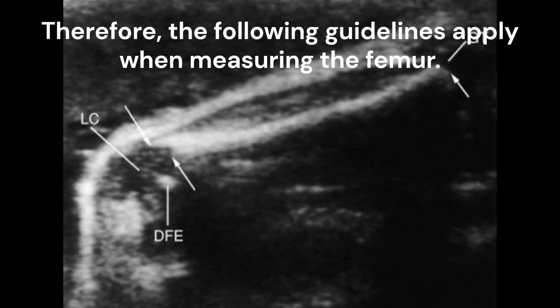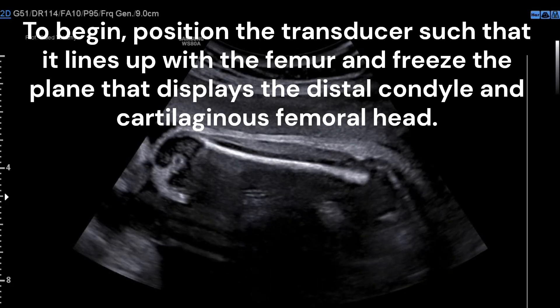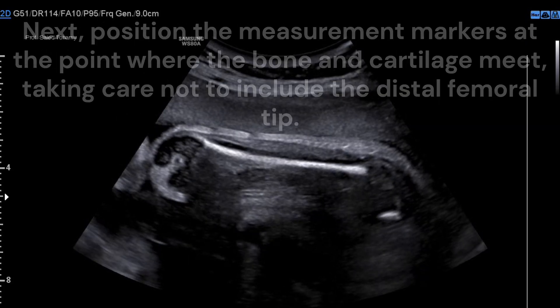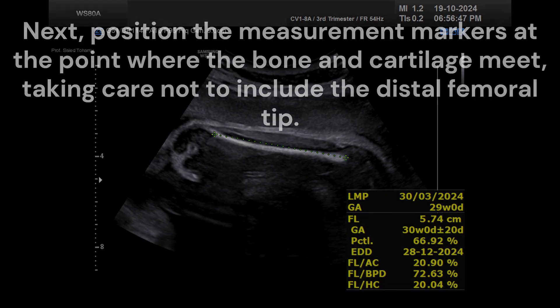The following guidelines apply when measuring the femur. First, position the transducer such that it lines up with the femur and reveals the plane displaying the distal condyle and cartilaginous femoral head. Next, position the measurement markers at the point where the bone and cartilage meet, taking care not to include the distal femoral tip.